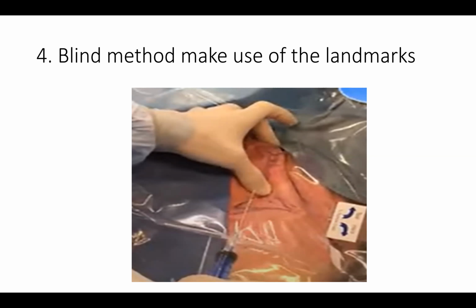What you do here is this. Once you scrub the patient and prepare the patient sterilely, the first thing you do is take your lidocaine. I usually use 2% lidocaine with adrenaline. Inject deep. That is the key thing here. I usually train my fellows that there are two ways to inject this lidocaine, the deep and the superficial. Your aim of injecting deep is that you numb all the area going towards the clavicle, and also inject around the periosteum of the clavicle.